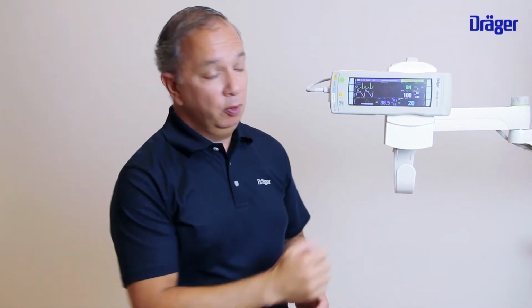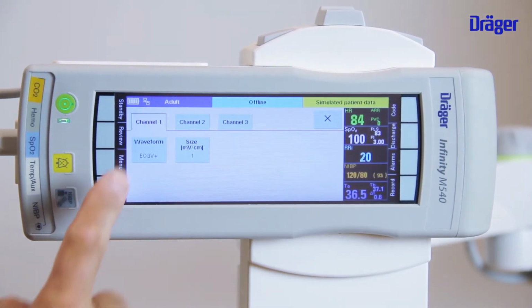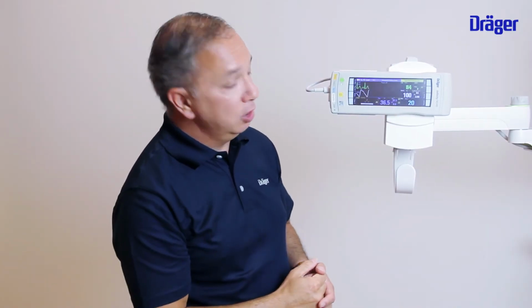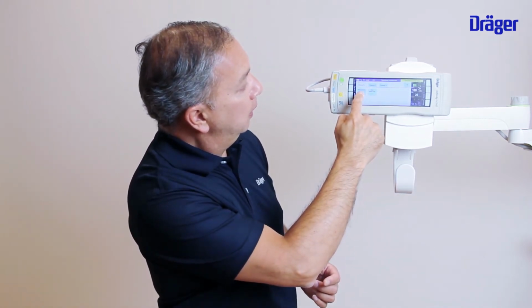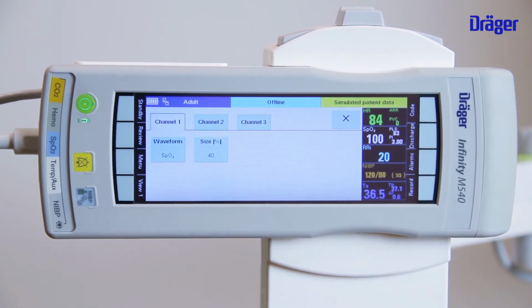When you touch the waveform box over here, you can change this waveform into another waveform. So now, for example, this is an ECG waveform on top. When you want to change it into something else, you can change the ECG into, for example, SpO2.